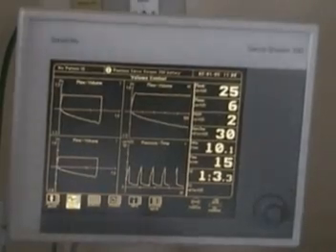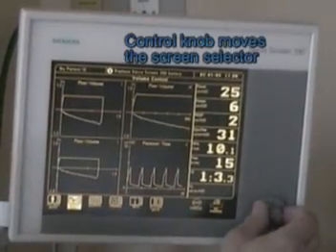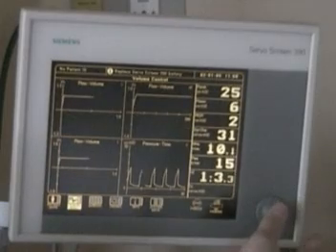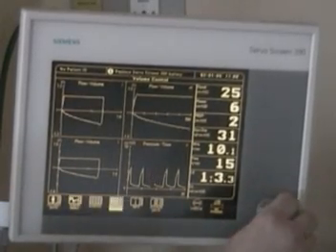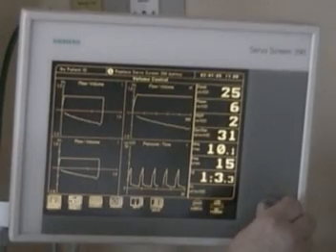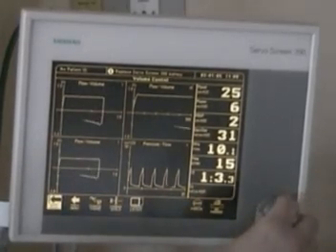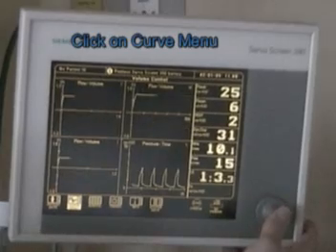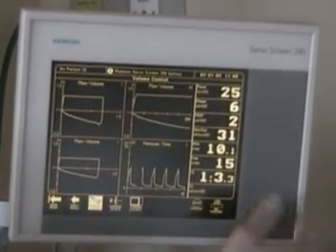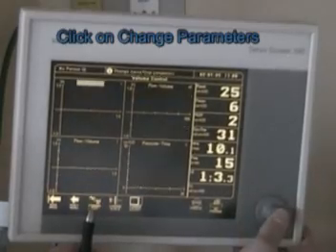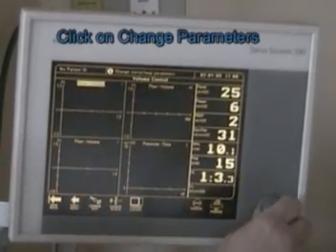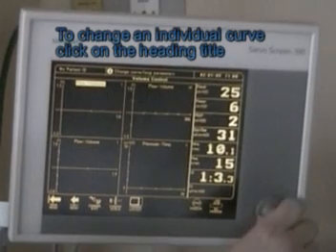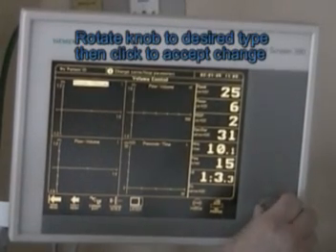We have several different loops. We have a control knob here, so let's go into this and we can make some changes. We're going to go into the curve menu — press the button in — and then let's change the parameters. We can click on it and change this curve: flow-pressure, we can change it to flow-volume or volume-pressure.